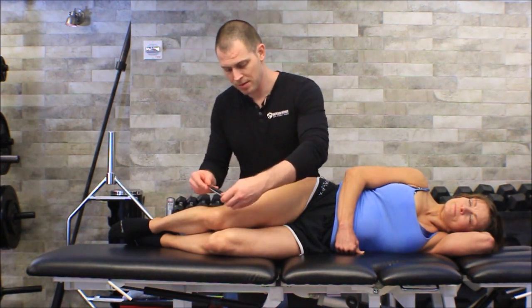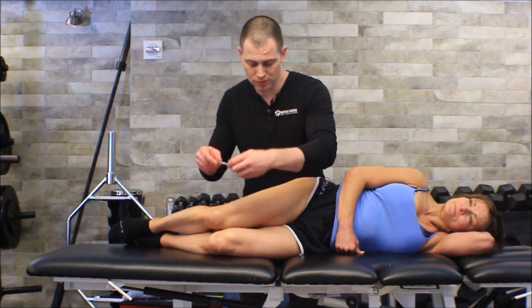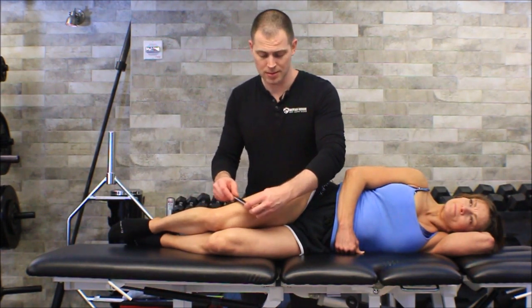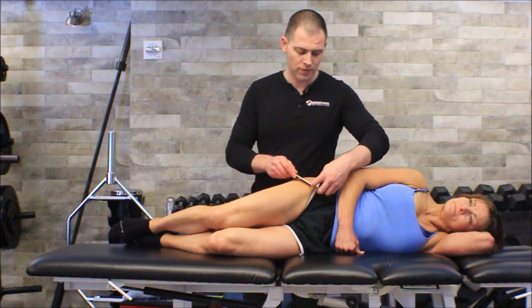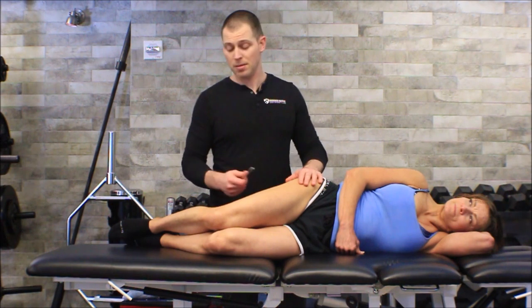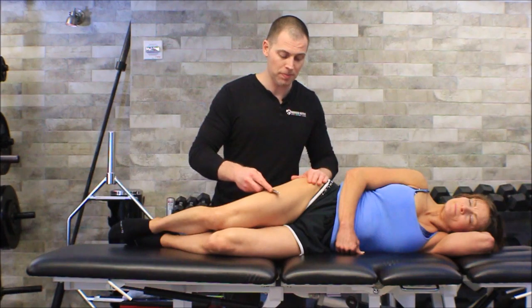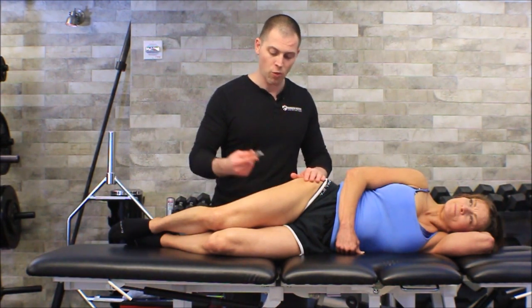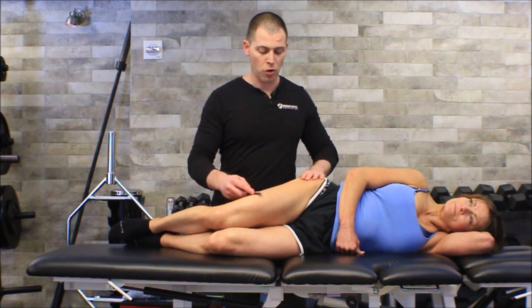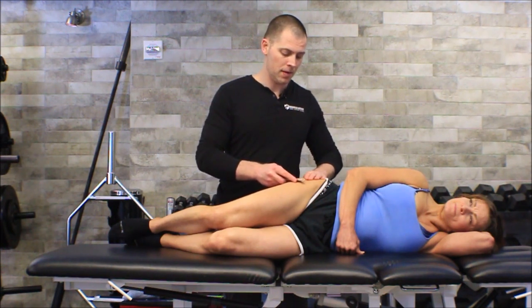Scanning here — 20 to 30 degree angle, pull through the skin. I'm at that 20 to 30 degree angle, just at the point where I'm getting a little push back from her muscle, and pulling through just like so. Now all of this area is going to feel bumpy. The lateral thigh all feels a little bumpy; what you're looking for is really bumpy spots or places where the tool gets stuck. You're going to need to lighten up over the iliotibial band — think of it the same way you would over the Achilles tendon when doing crural fascia IASTM.